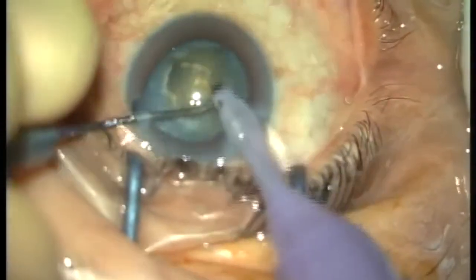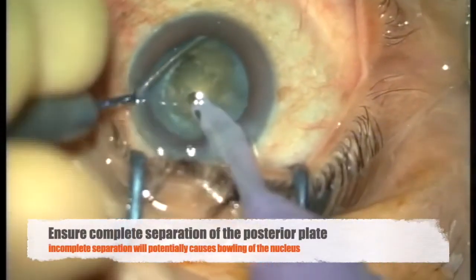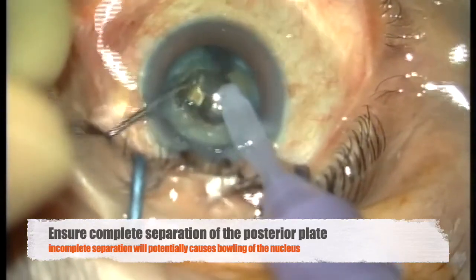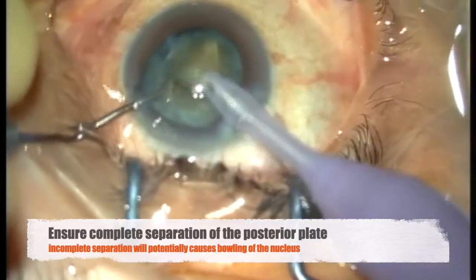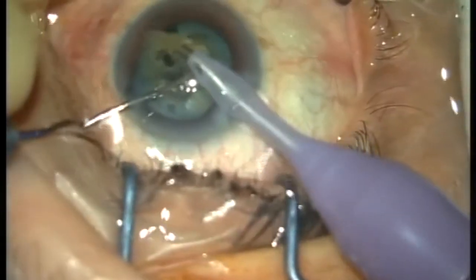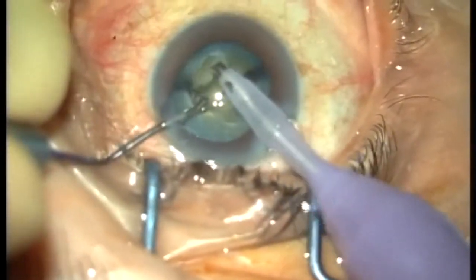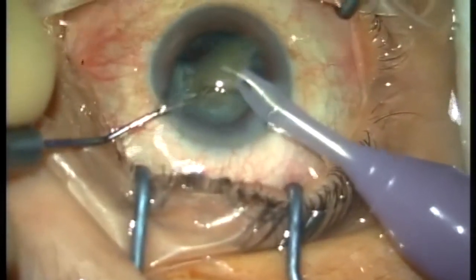Once cracked, we will rotate the nucleus. In this case, we were using the stop and chop technique. This is the horizontal chopping in which no vacuum or phaco power is needed. Manual separation was done in a controlled manner. Once the first piece is out, manipulation of the remaining nucleus becomes much easier.